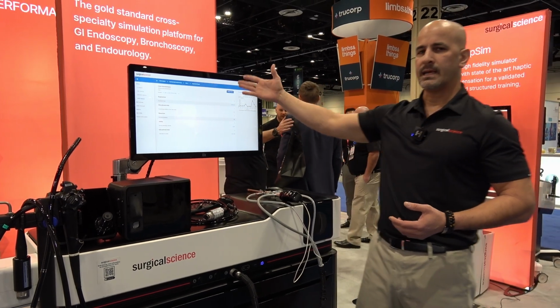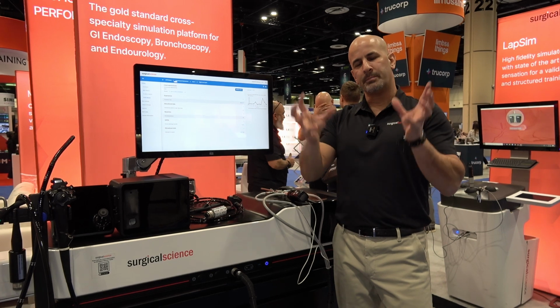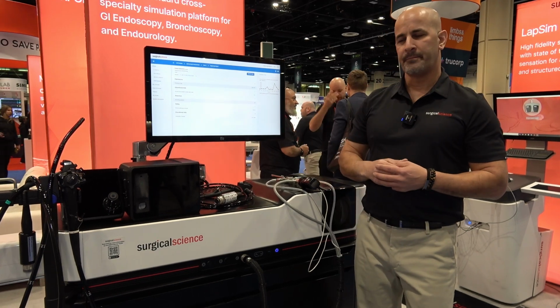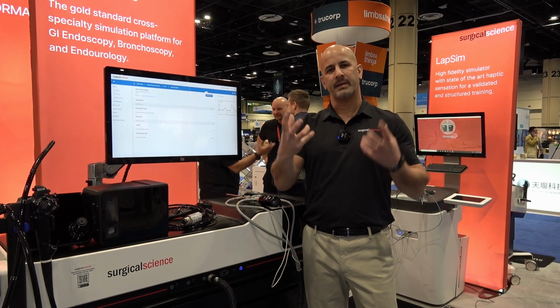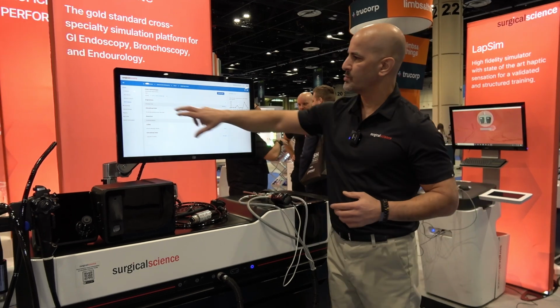The feedback itself, the performance report, does not say anything about good or bad. These are objective and technical information that allows the faculty to judge whether or not the training was doing a good job. Some of these features will have graphic analysis, which will allow the student to get that immediate feedback. And of course, will also allow the doctors to get that as well.